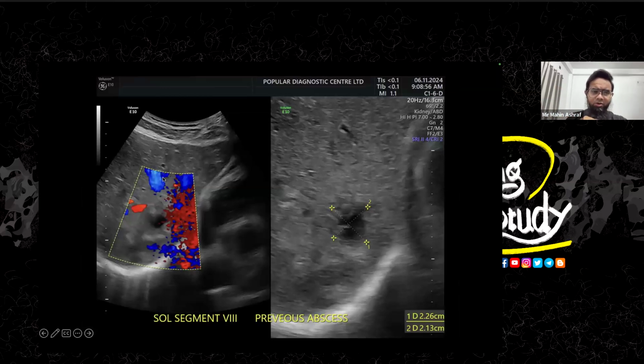You see only regular hepatic vessels are present here, so not much vascularity. These artifacts are coming from the cardiac pulsation. It's quite small in size right now, but it's ill-defined, so the measurement should not be quite accurate.